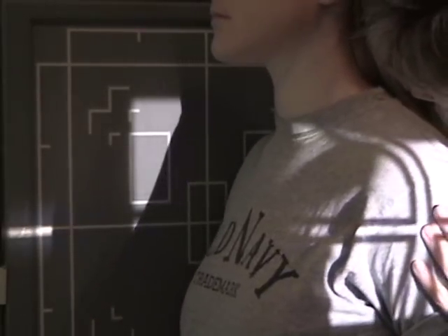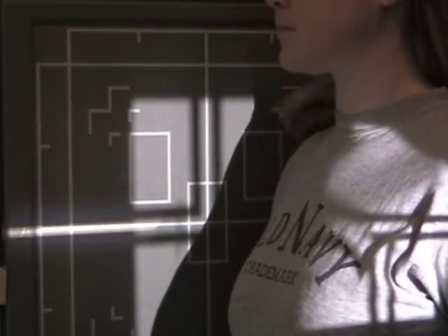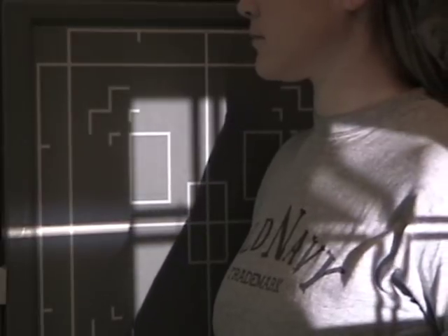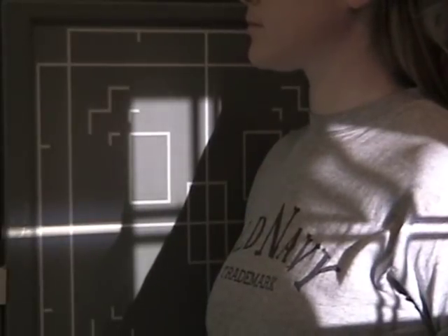If you were centered like this, you can tell that the xiphoid is going to be projected outside of the field of view. Or if you're too far back, here's the center of your film and you have nothing up here. So use your hints here. Xiphoid process, slightly behind the center of the film.